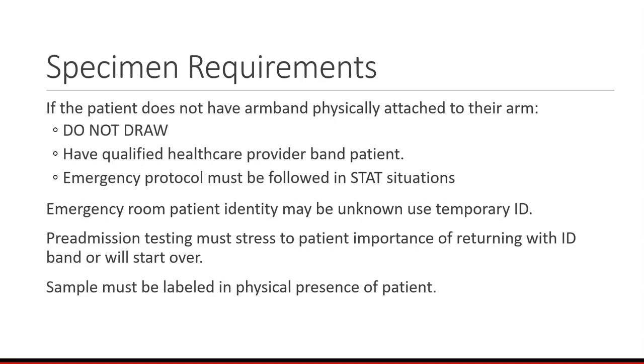At our facility, to make it very apparent that the patient's identity was unknown, they have these kits for unidentified patients. This would be Donald Duck. This would be Mickey Mouse. They're just names that are so out there that it's obvious it's not the patient's real name. Of course, in this day and age, maybe somebody named their child Mickey Mouse. Who knows? But just know that there are protocols.